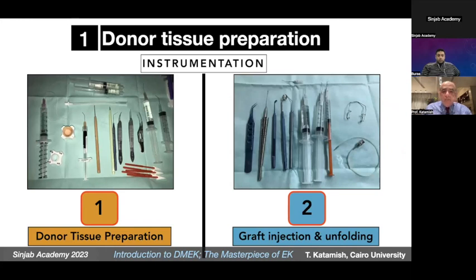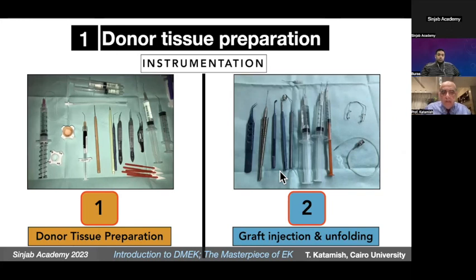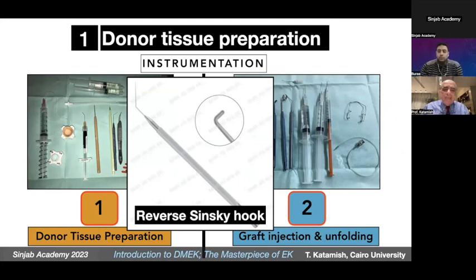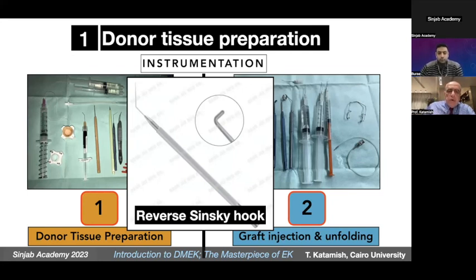The instruments are very simple — ordinary cataract and corneal instruments — not specific for DMEK except one: the reverse Sinskey hook, used for descemetorhexis in both DMEK and DLEK procedures. These are basic instruments; you can work comfortably with any anterior segment instruments.